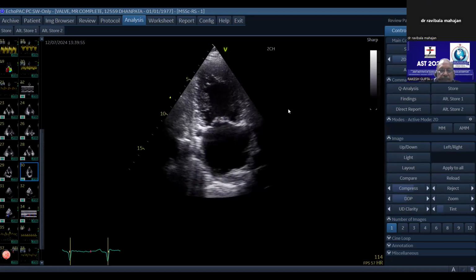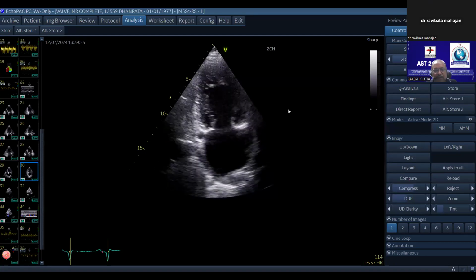I don't know the model, sir. Okay. On a GE machine, in front there will be knobs for the Nyquist limit. Two knobs are there. One will talk of the scale, the second will talk of the baseline. If you move the baseline down, the baseline will go up or down. The scale will go down, on both sides the scale will go down.